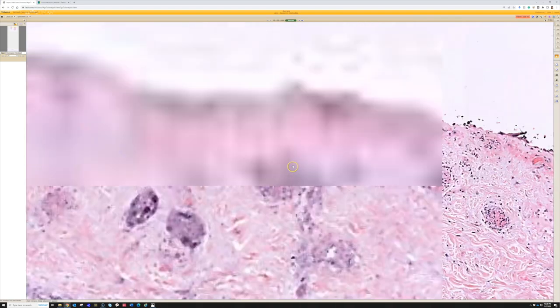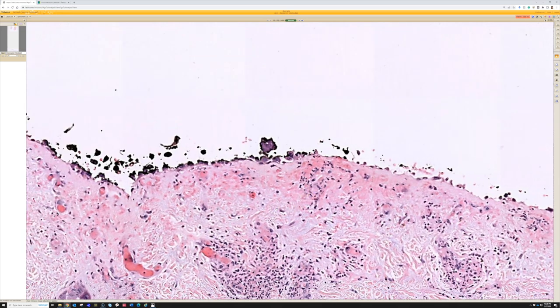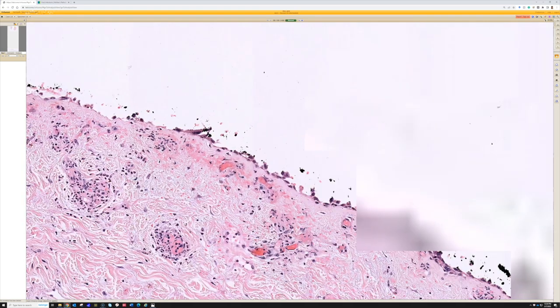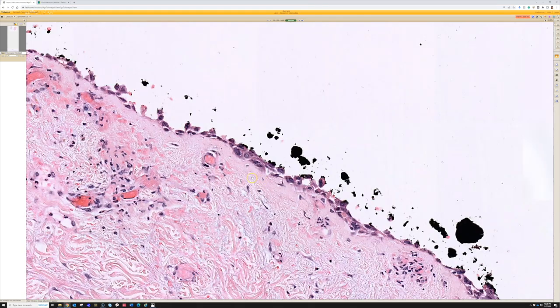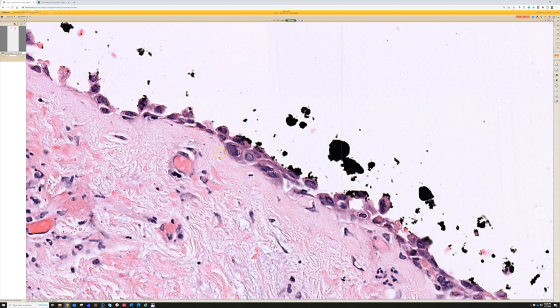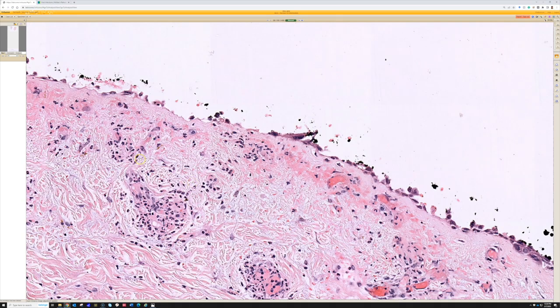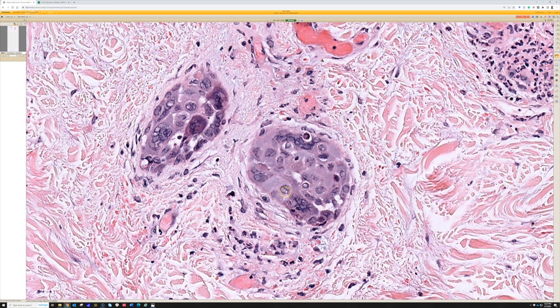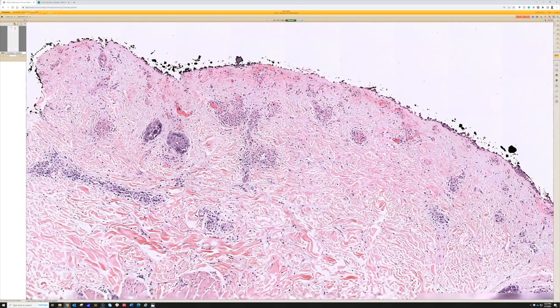On the other side of the biopsy, this is what happens when the roof of the blister has totally sloughed off and detached — true of any acantholytic blister. You can see a tombstone row of basal keratinocytes, mostly intact, just like you'd see in pemphigus. There are subtle hints of viral cytopathic effect, and down the adnexal epithelium you can see better multinucleation, margination, molding, and that smudgy hazy ground-glass nuclear chromatin pattern typical of herpes. There's also a lot of inflammation in the background dermis, another typical finding.